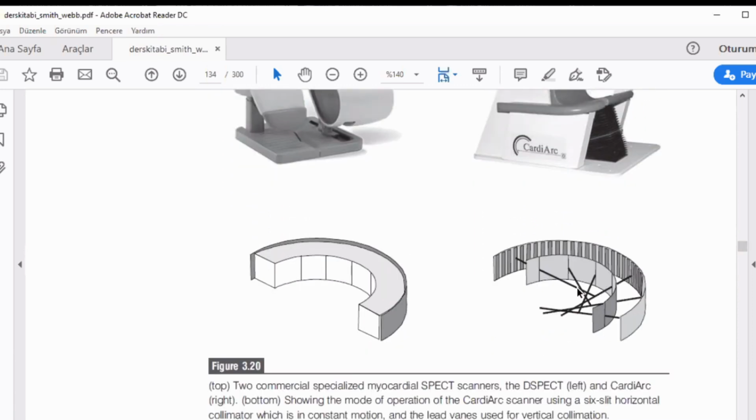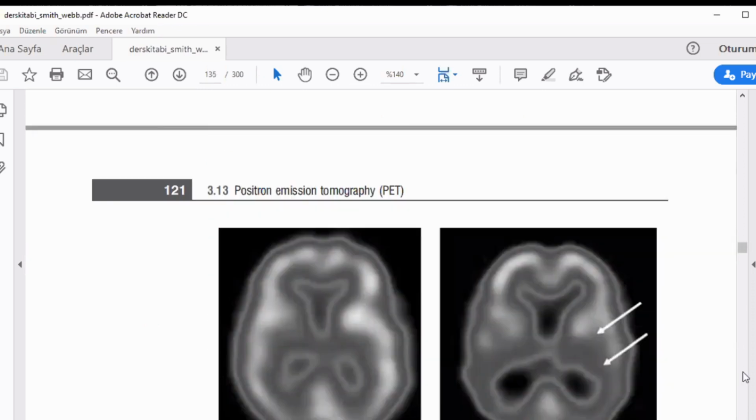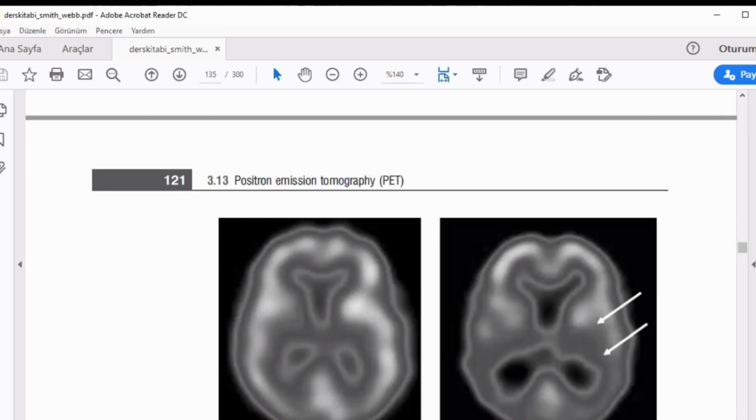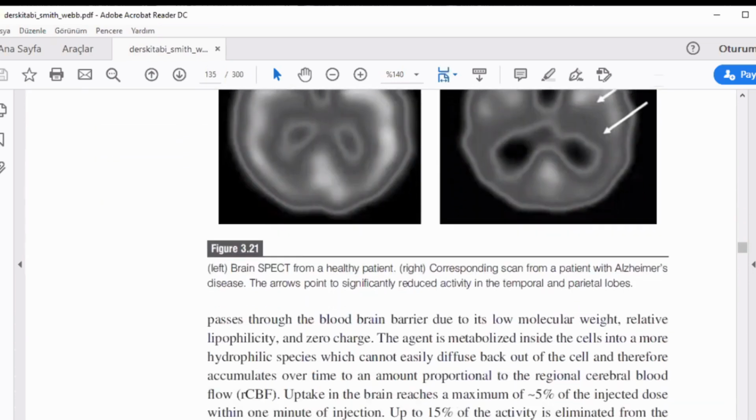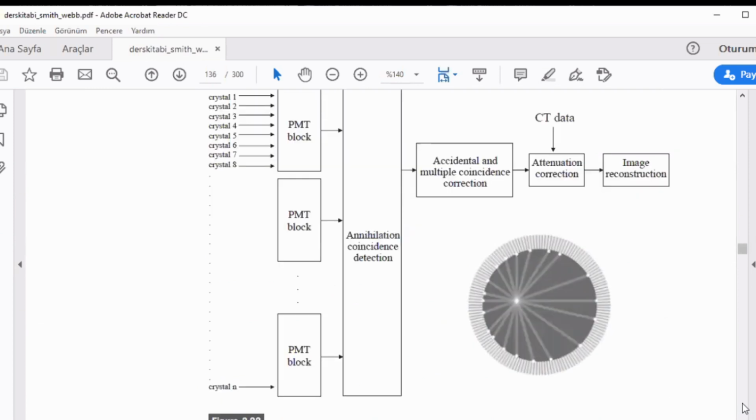Their detector, collimator structures, etc., in principle, are the same as our planar scintigraphic equipment. There are some special systems for brain, for heart, etc. You see, here's an image of the brain, and the problematic things are indicated, and some hardware about the tube in an Anger camera of these kind of systems.